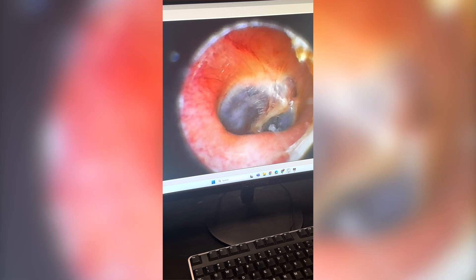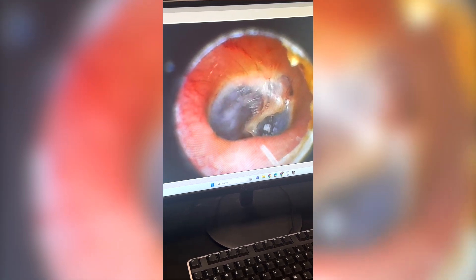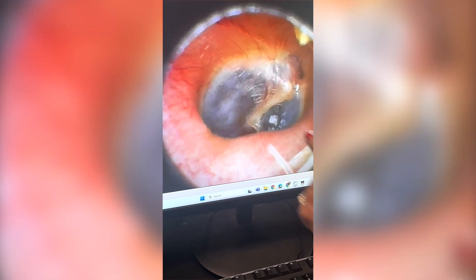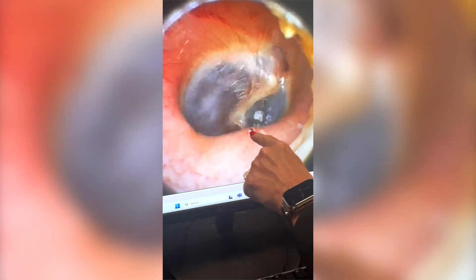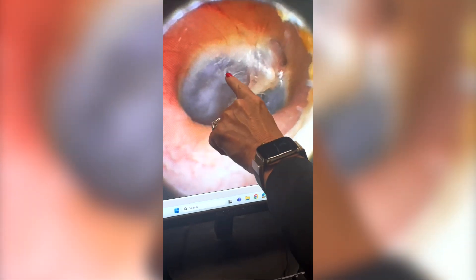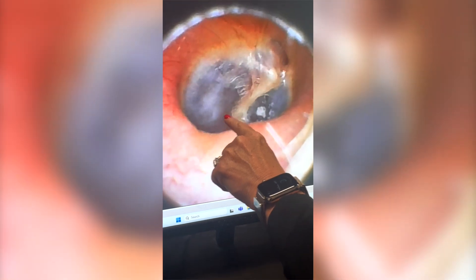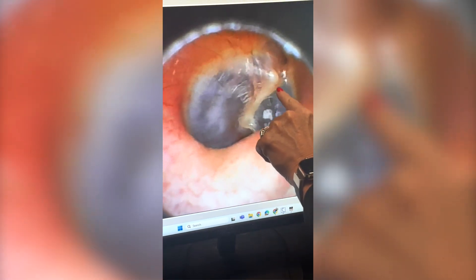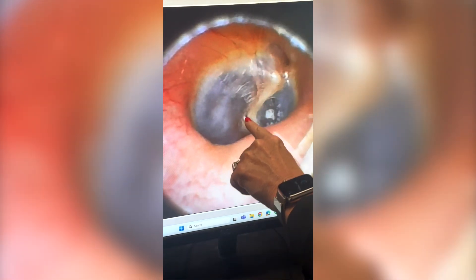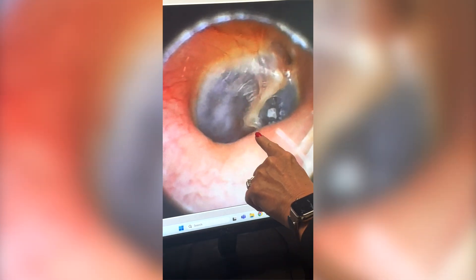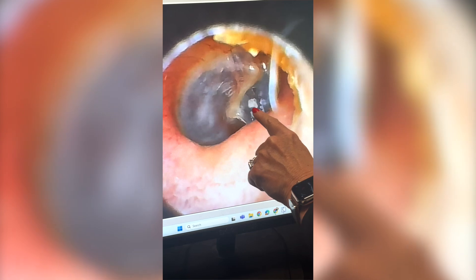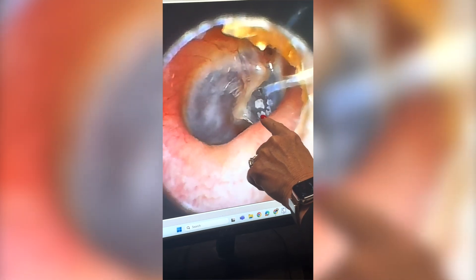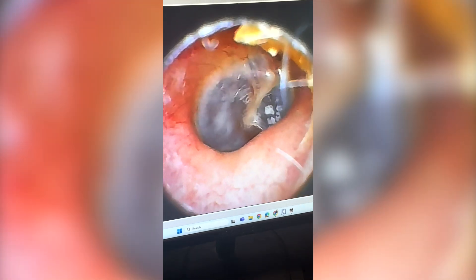And then if I get really close, this is my eardrum — just a little thin membrane. These are the bones inside my ear. And then this right here, that's scar tissue.